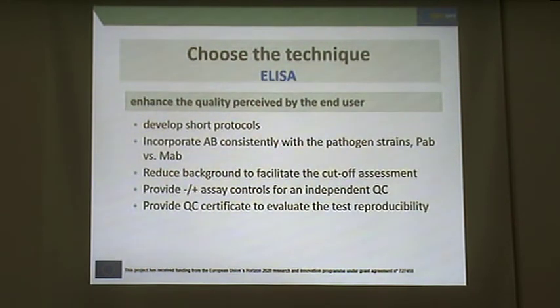And how we enhance the quality of the diagnostic tool as it is perceived by the end user. Generally, the end users prefer short protocols. They want to know if we are using polyclonal or monoclonal antibodies because it has to do with the specificity of the test and the variability of the target pathogen.